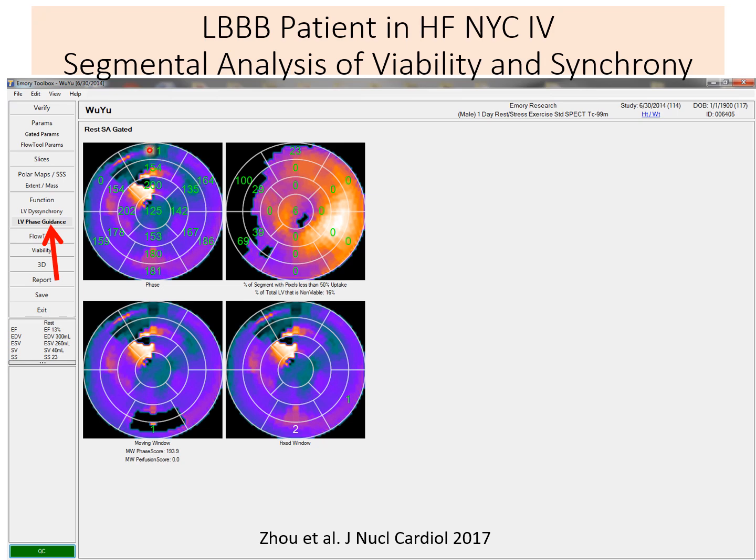And if you look at the possible segments where you are not allowed to put the lead, either in the apex or the septum, you want a delay between the septum and the rest of the ventricle. You can see that perhaps this is the one where it should be placed. Now, this is 186, 181, and 180.